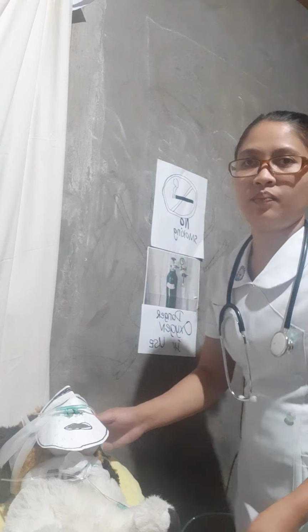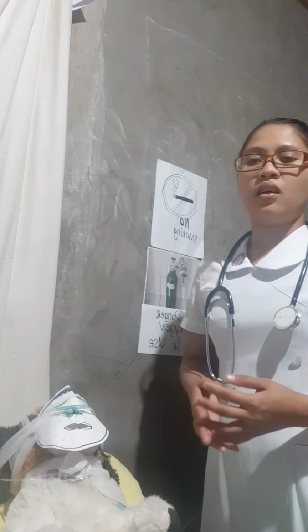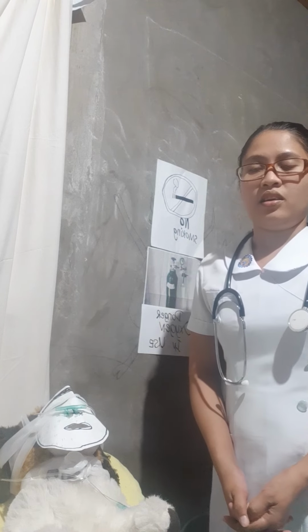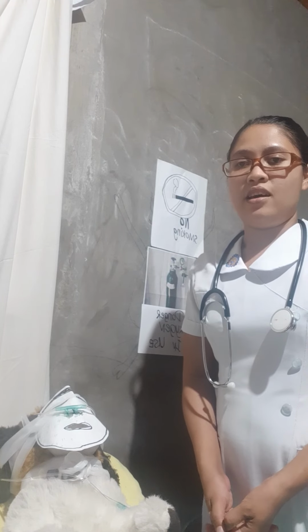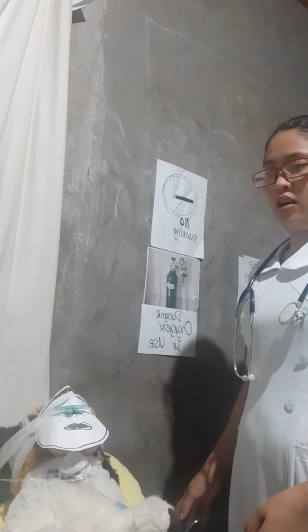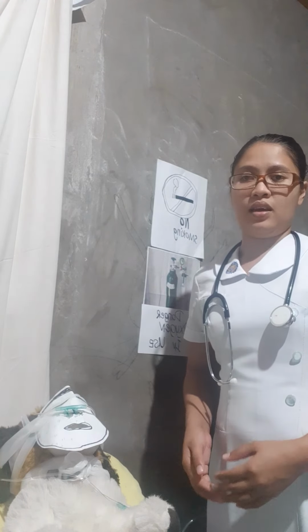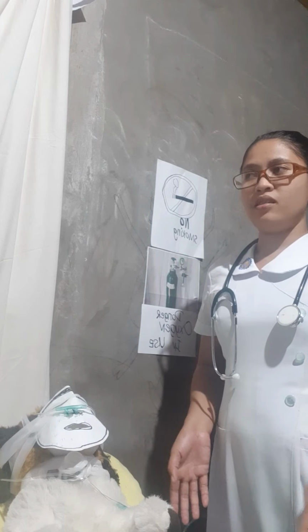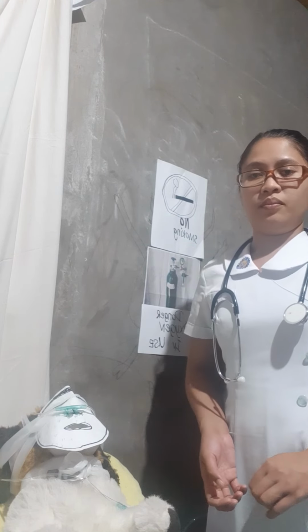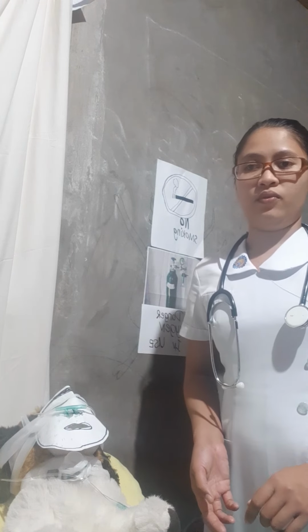Next, the equipment should be in the area closest to me, and the table will be at waist level so that we can save time and effort.